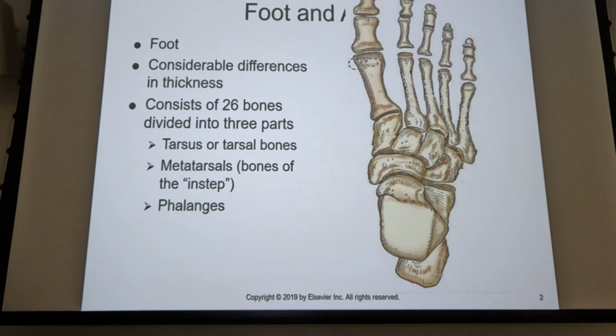You probably won't, because the computer algorithm allows you to visualize both the distal and proximal end of the foot. But because the foot is a wedge shape, a pretty steep wedge shape in some people, with the toes relatively thin and the proximal portion of the foot being pretty fat, what we would have to do is utilize a filter, just a chunk of aluminum, and the fat end of the aluminum would go over the toes and absorb more x-rays before they reached the toes, thereby lightening the density over the toes.